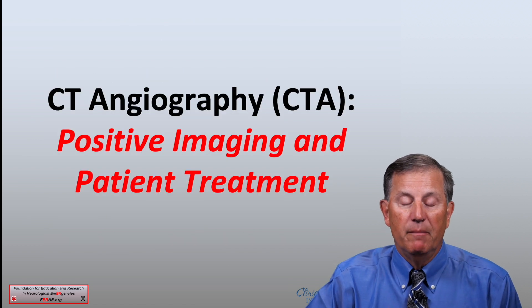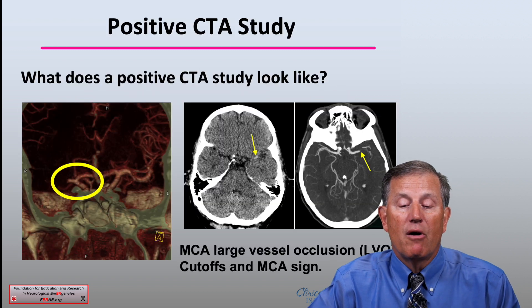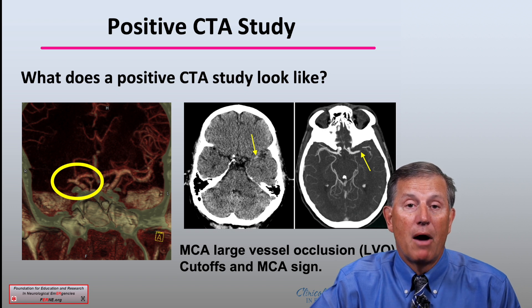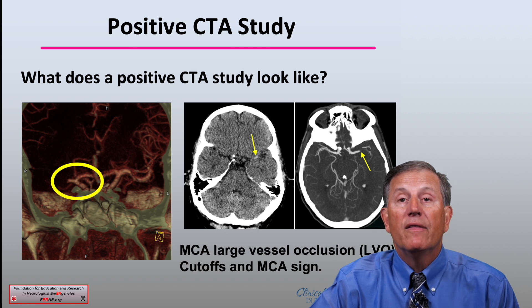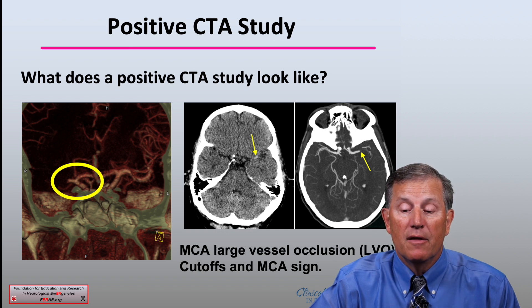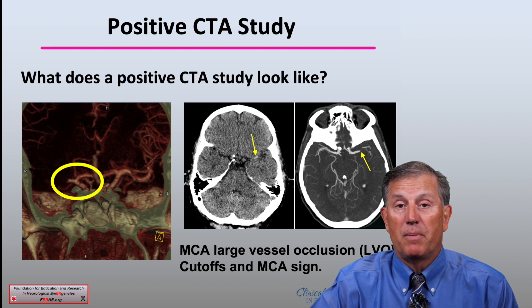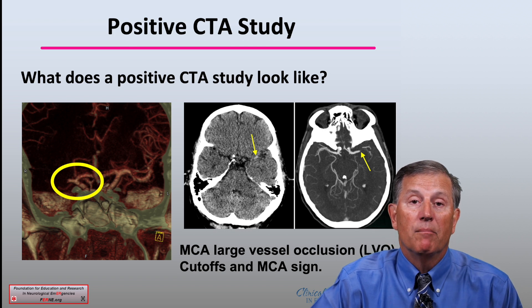What about positive imaging and patient treatments in patients with CT angiograms? You see here on the left, a cutoff in the middle cerebral artery in the yellow circle related to a thrombus or embolus. This MCA large vessel occlusion shows you on the right, in the area with the yellow arrows, the presence of the clot within the MCA itself called the MCA sign. This is apparent on non-contrast CT and does not require a CT angiogram to observe this.